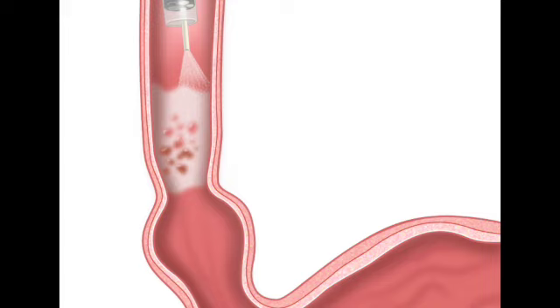Well, they do react, but this is where timing becomes everything. Timing. Yeah, the entire diagnostic process becomes a race against time. The doctor's watching the reaction happen in real time on the monitor. When the acid is applied, the healthy tissue turns white and stays white, only gradually fading back to pink over a longer period. Right. But the neoplastic tissue, the dangerous dysplastic cells, loses that aceto-whitening much, much faster. So the healthy cells hold on to the white disguise, but the dangerous cells drop the disguise almost immediately.